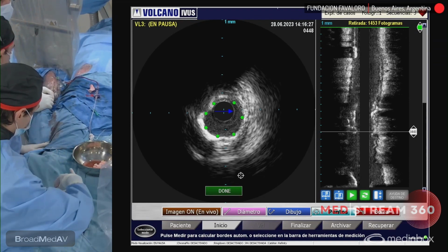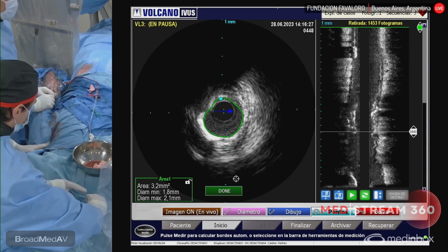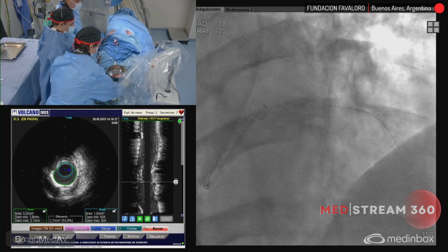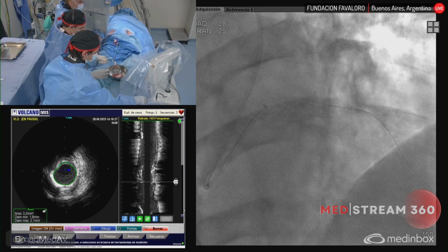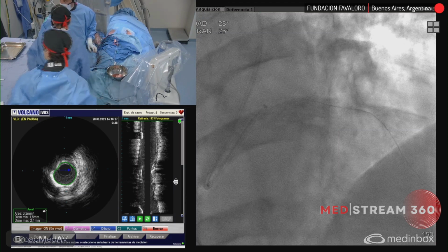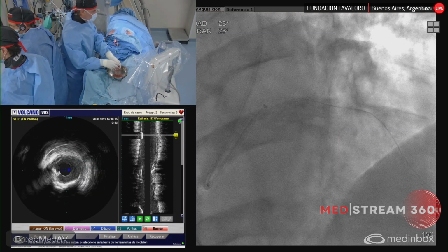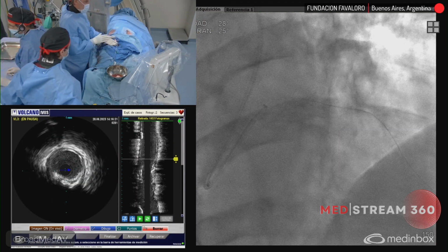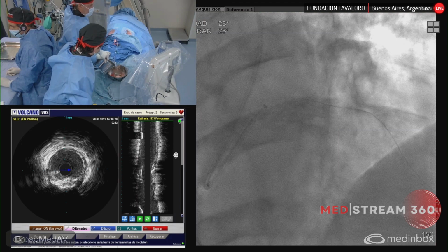So we have there a 2.5 diameters on the vessel, probably 3, with a tight and concentric calcification. So there, we can use an Apollo non-compliant device, 2.5 by 20 or something like this. This is a non-compliant device from Brosmed. This is only 3% axial growth when you inflate at very high pressure.